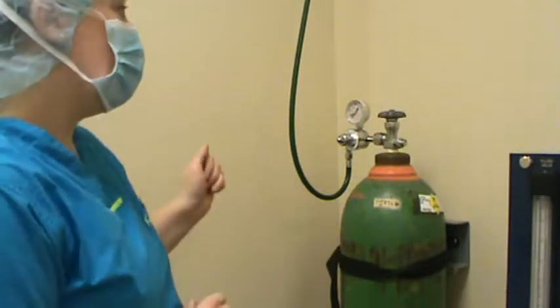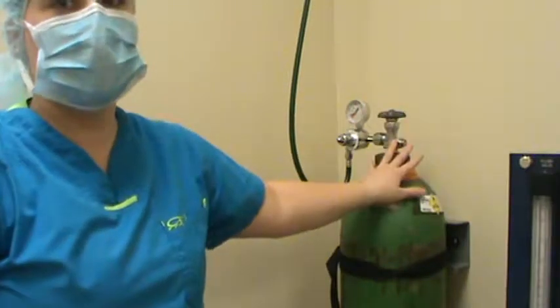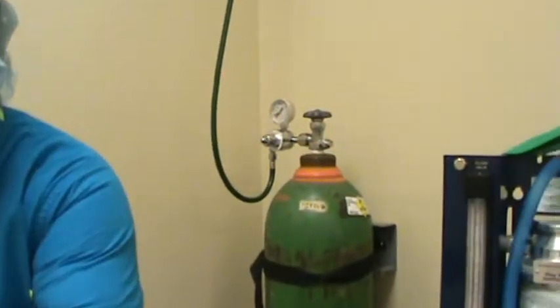Hello, this is Chelsea Marks for VETT 221 task number one. We're going to explain how to use the anesthetic machine. Step one is to make sure that your source of oxygen is on and that you have an adequate amount.